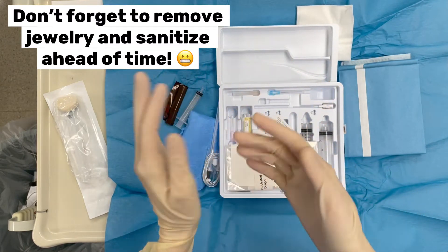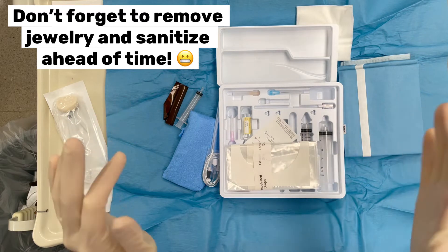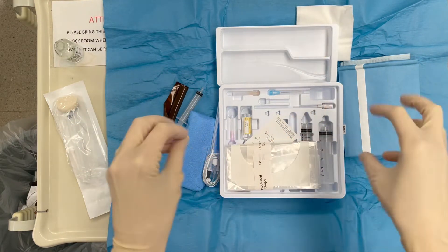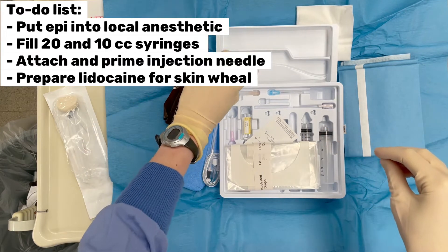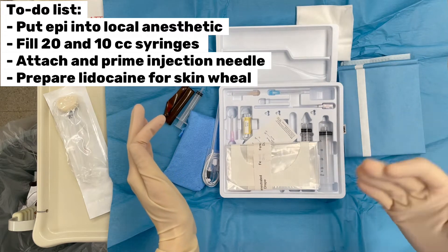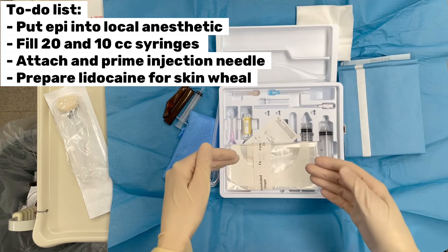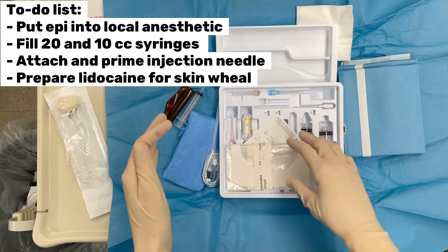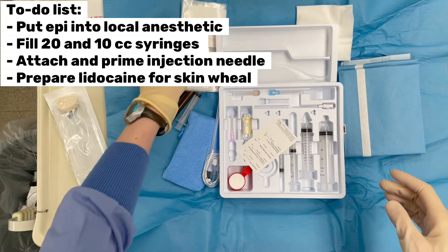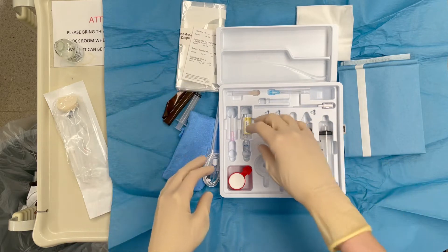You should probably take your ring off and wash your hands ahead of time — which I did not do, but I'm only doing this once. So we've got our local in there. What we need to do now is put some epinephrine in our local and prepare a lidocaine syringe for our skin wheal. Then we'll put our local in our syringes and attach that to our needle to get the injection ready.